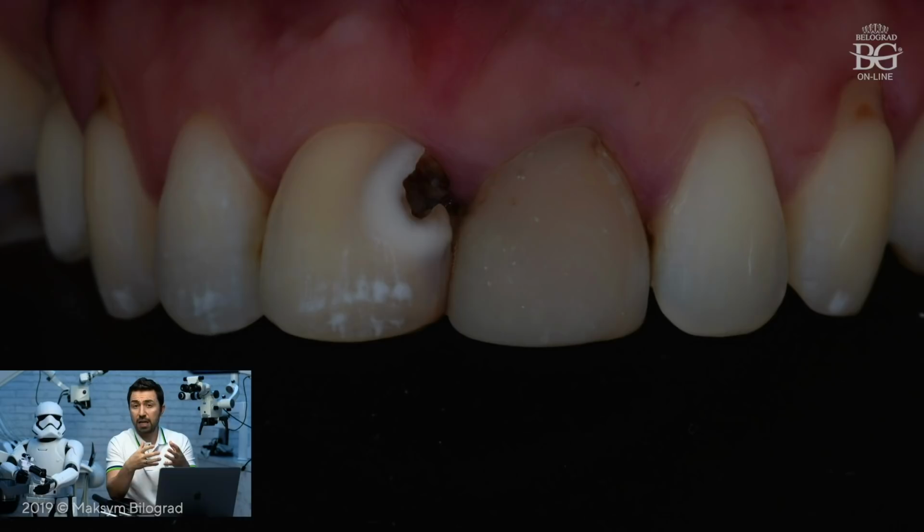Even we can see a lot of cases with metal-free ceramic restorations and with such inflamed gums because of the biological width. So in this case, we offered crown lengthening, and crown lengthening also was refused.